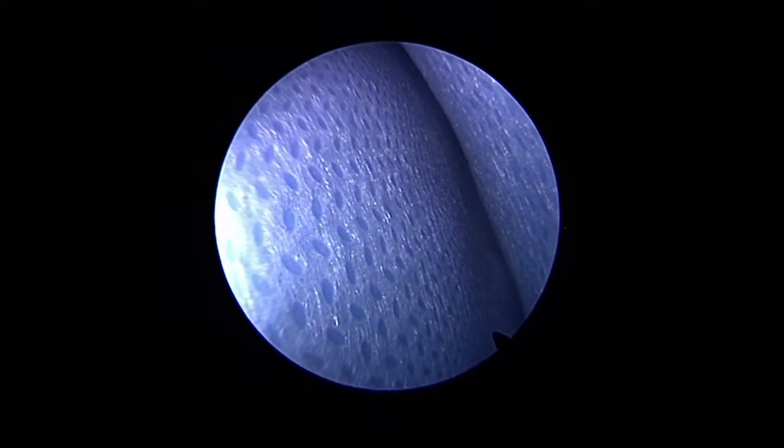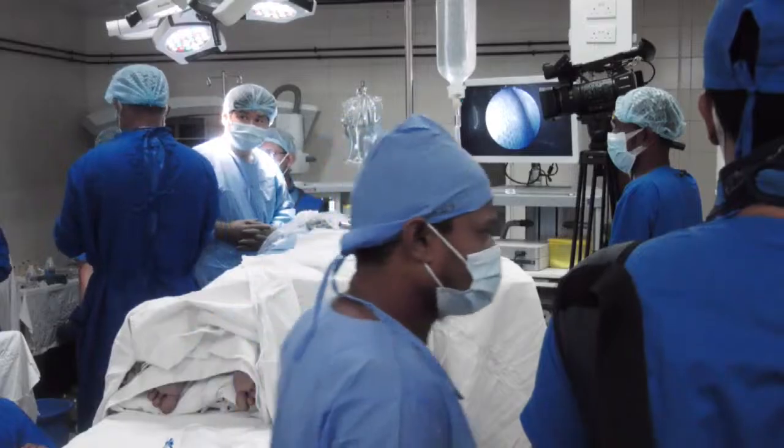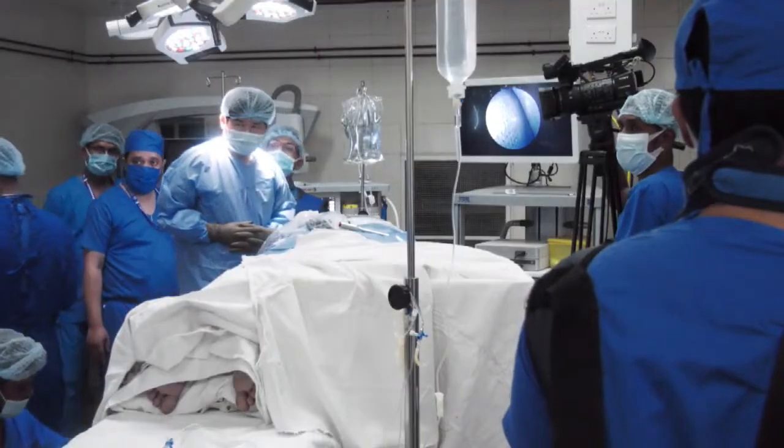We need... combination. Okay. I am giving you the max for scope. You just start. Okay.